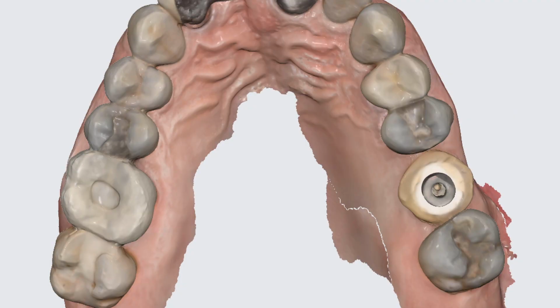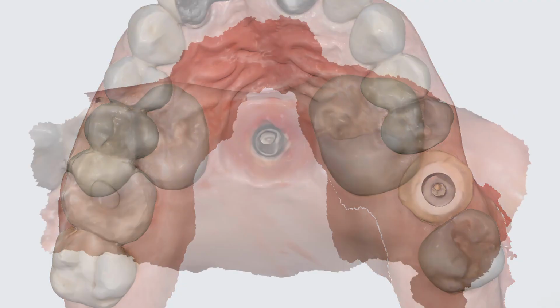And I just go ahead and scan the neighboring teeth, and I normally do a full arch scan, even if it's a single implant, just because I feel that it's a lot easier for the lab to articulate these models. So, let's say that I'm placing an implant on site number 5. I'm going to do a full scan of the maxillary arch, and I'm going to scan that customized healing abutment initially. Once I do that, I remove the customized healing abutment, I place my scan body, and now I'm going to scan my scan body and the tissue around the scan body.